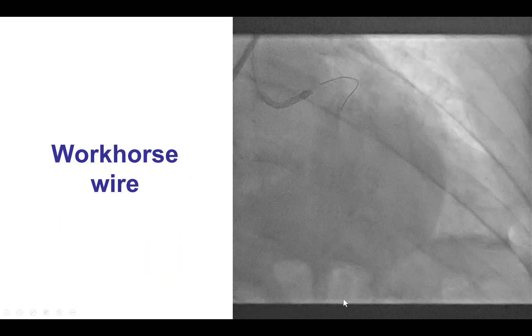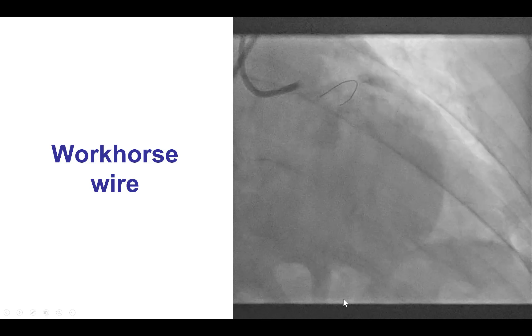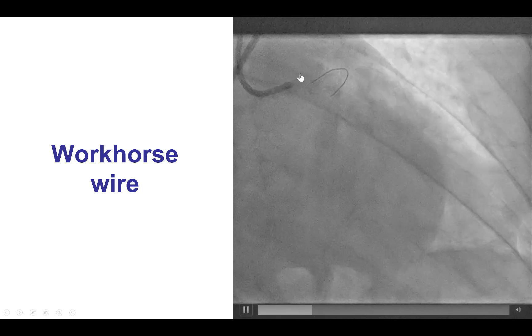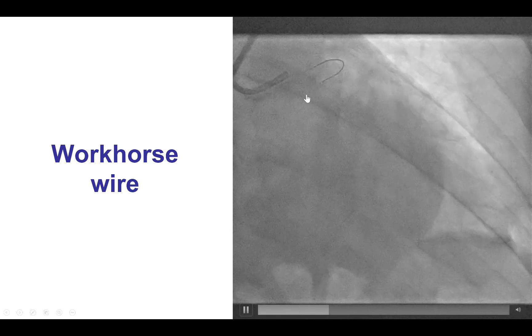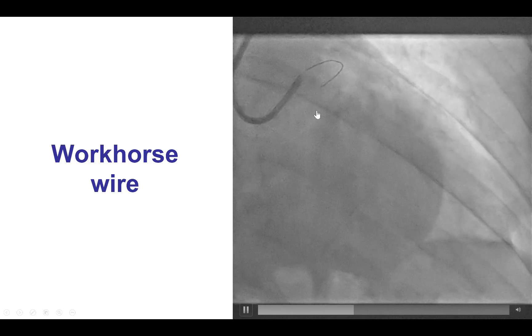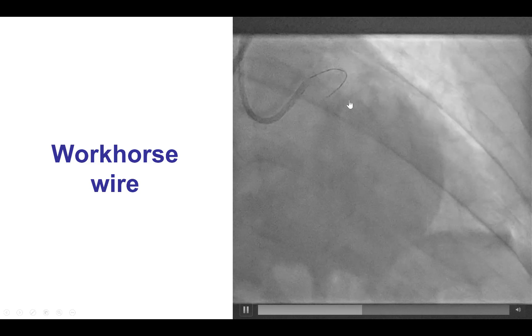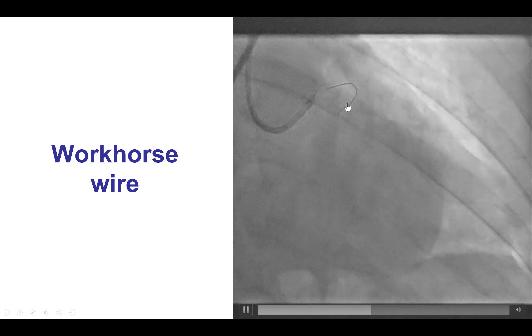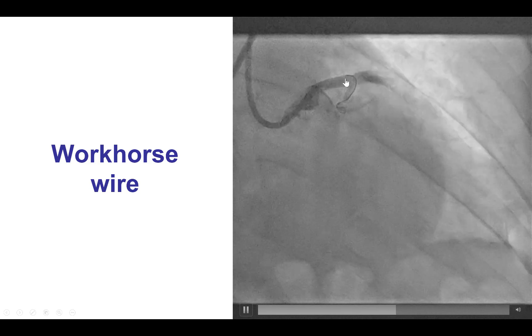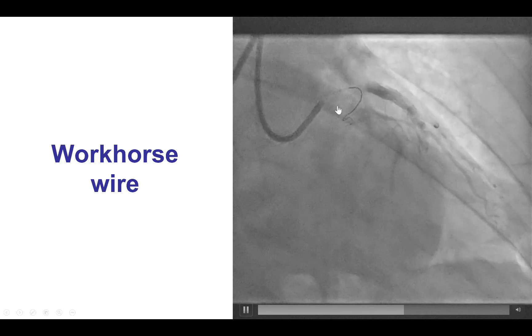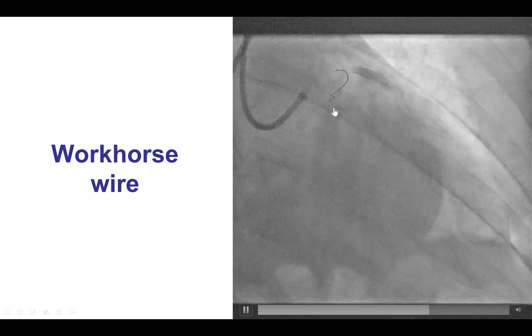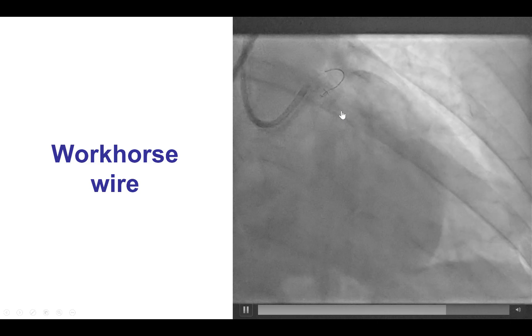But sometimes things may work better than expected. These are repeat attempts, still using a Workhorse Xion Blue guide wire. There is essentially a 180-degree bend, but slowly the wire seems to be taken through the first bend and the second bend, and now the tip is prolapsed.